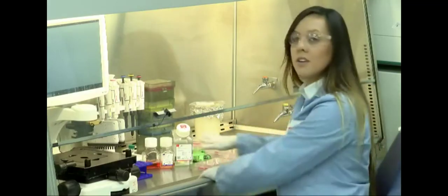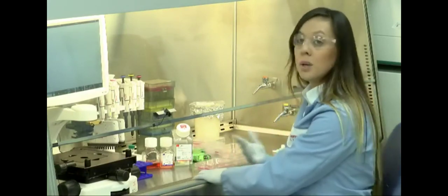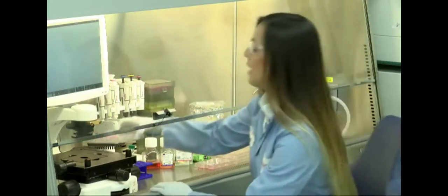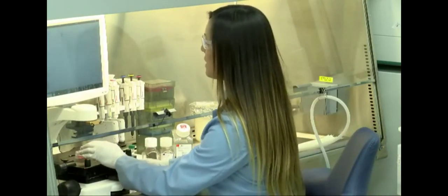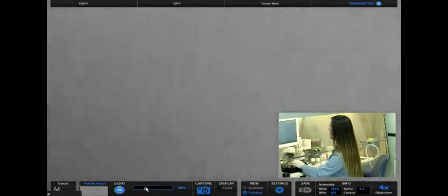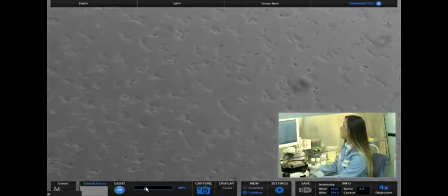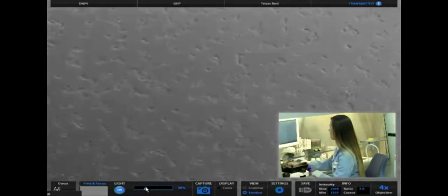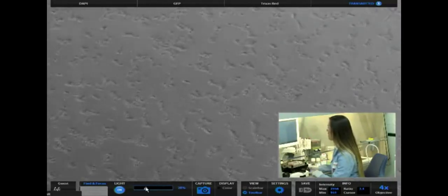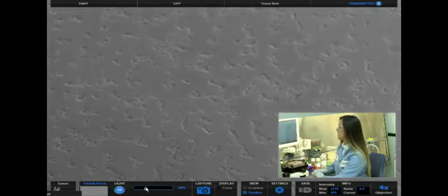So once you have your day seven, we make those neural stem cells P0, and you want to replate. So we'll actually just replate with Accutase. And I'll give you an example of how they should look once they're replated. So if we go back on the EVOs, these are some good replated neural stem cells right here. So we usually plate 1 million per six well, which is what we've got right here. And they're smaller, and they're quite dense as well. And you can already see that some of the cell types have little extending processes, which is what we want.